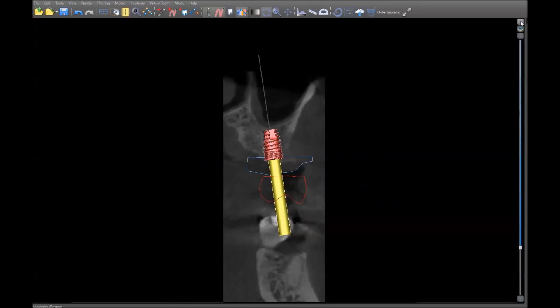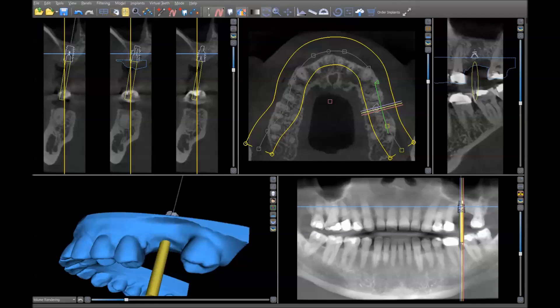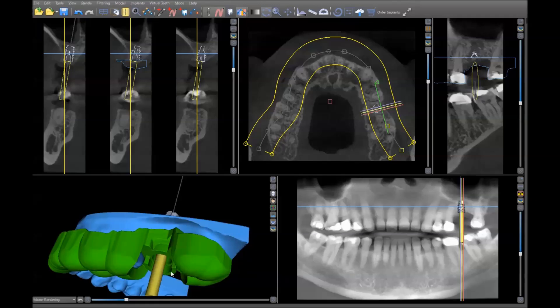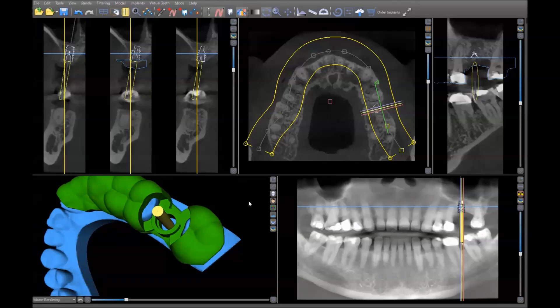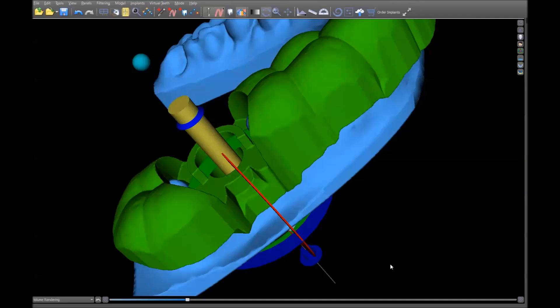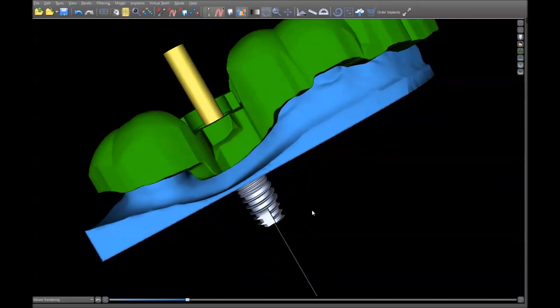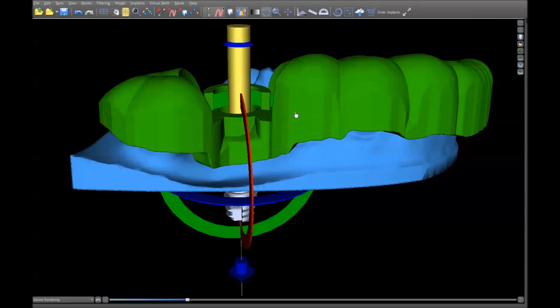This is a 5x8 implant. Once we've done that, we can go ahead and turn all these things off and design a surgical guide. As you see here, we've designed the surgical guide — you'll notice that there is a stop built into the guide itself, and this is what will depth-limit us when we're doing the actual surgery.